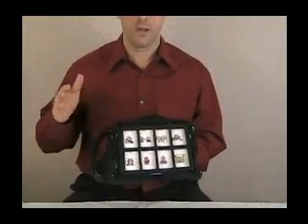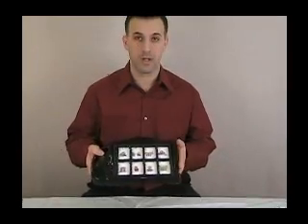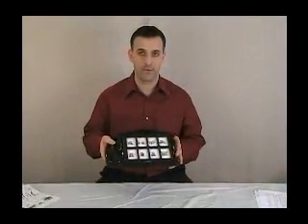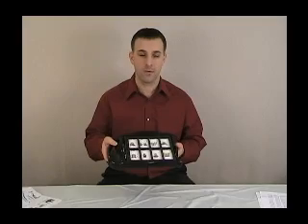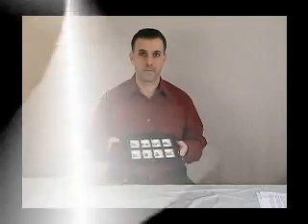So basically, a level is a retained set of messages, and this machine has multiple levels, so you can go back and go in between the different levels depending on what you're trying to use the device for, whether it's for daily activities or for going on a trip somewhere. You can record your messages.